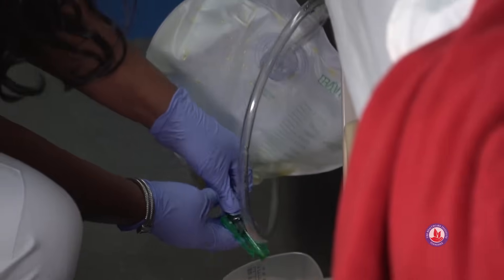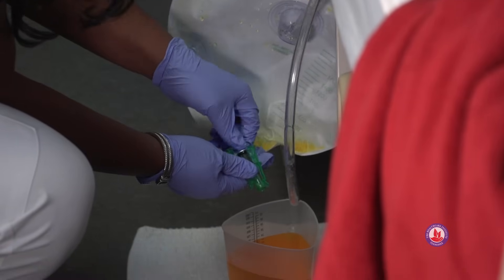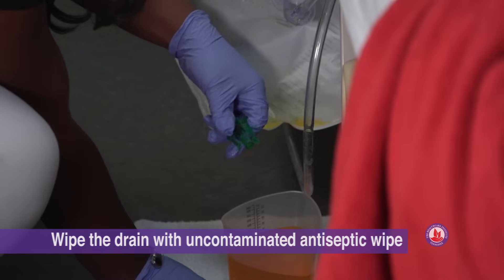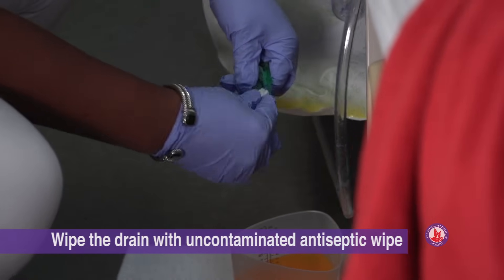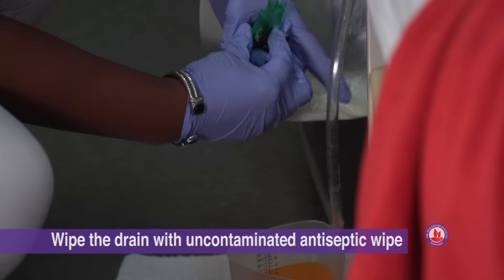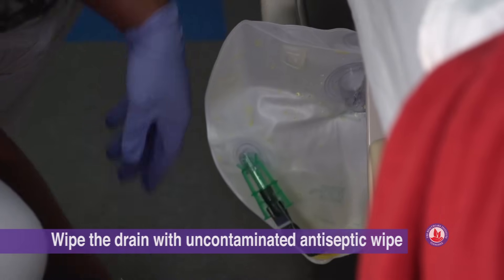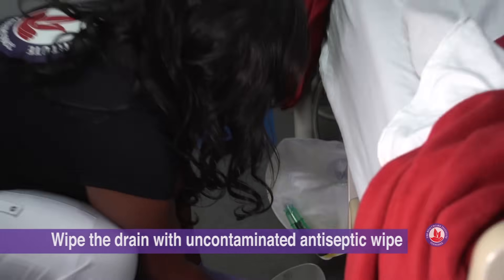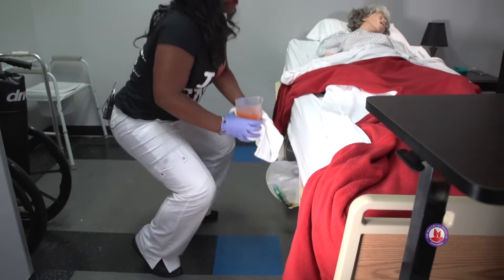Now that it's empty, we're going to clamp the silver part just like that and we're going to wipe with our antiseptic wipe, wiping around the rim and in the tip, and we'll replace it. Now we're going to gather all of our things including the barrier and our graduated cylinder to take it to the countertop to read it.